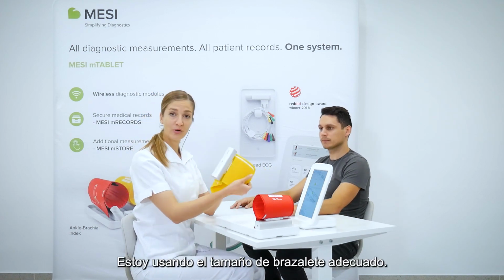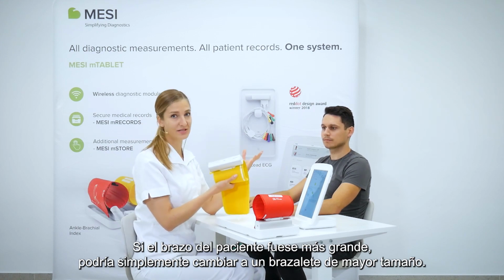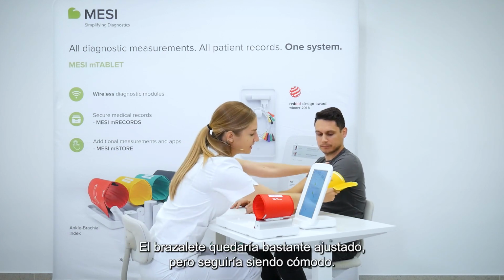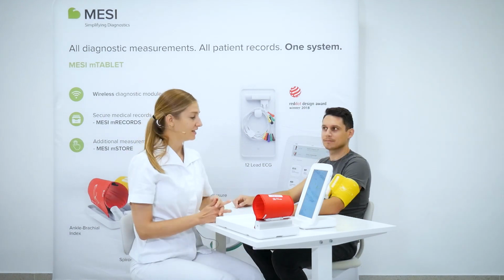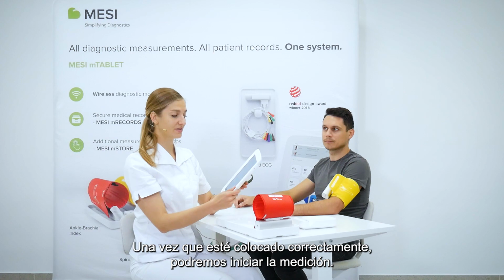I'm using appropriately sized cuff. If the patient's arm would be bigger, I could just simply switch to a large sized cuff. The cuff should be pretty tight, but the patient should still feel comfortable. Now that the cuff has been positioned correctly, we can just start the measurement.